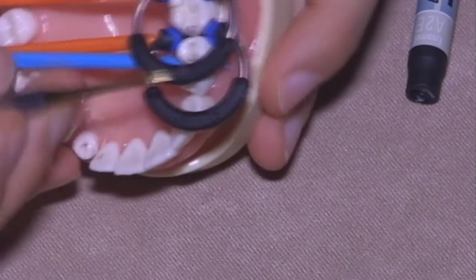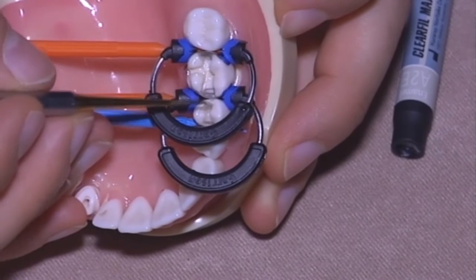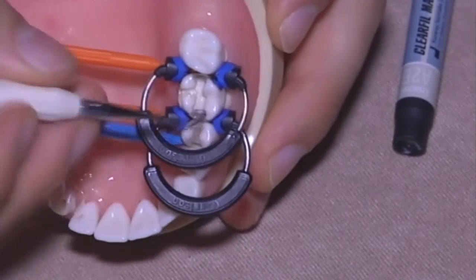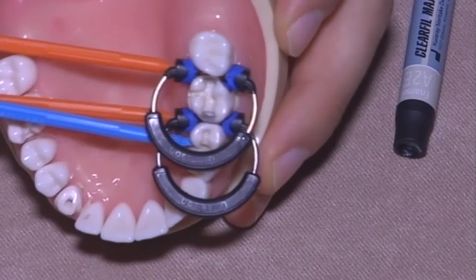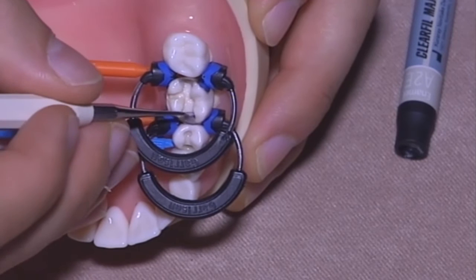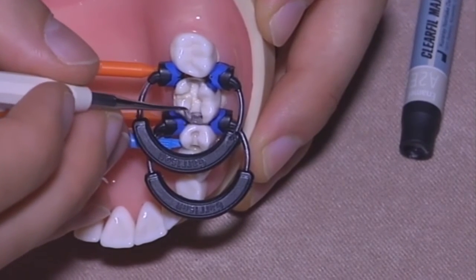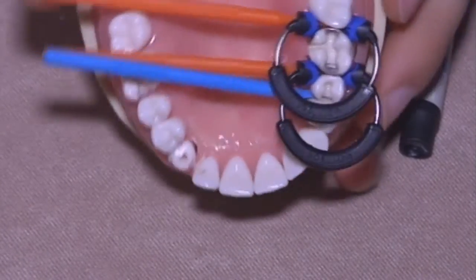Adaptation of the composite to the matrix. Again, one, two, check that you closed everything, okay, and then light cure.